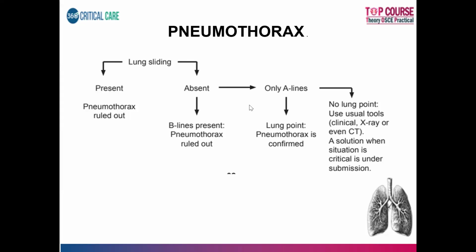There are a lot of protocols which are usually present, especially for the diagnosis of acute respiratory failure, like the BLUE protocol, etc. which use some of these findings to categorize various pathologies in the lung. I'll be dealing with that in the later slides.